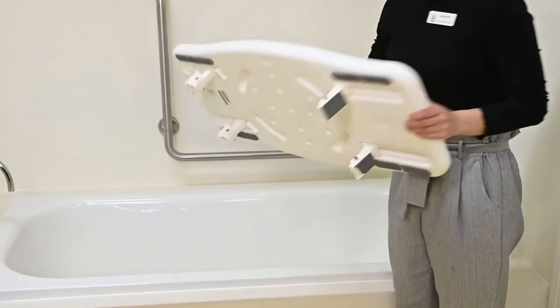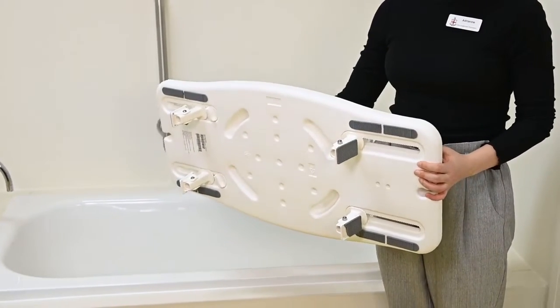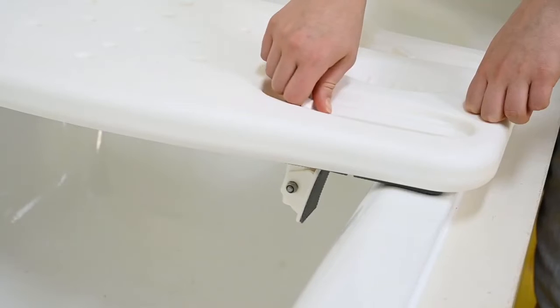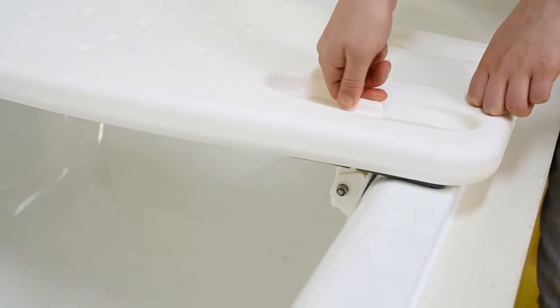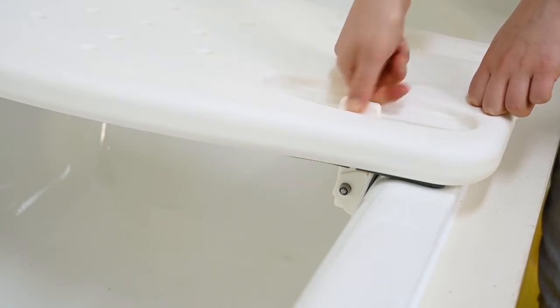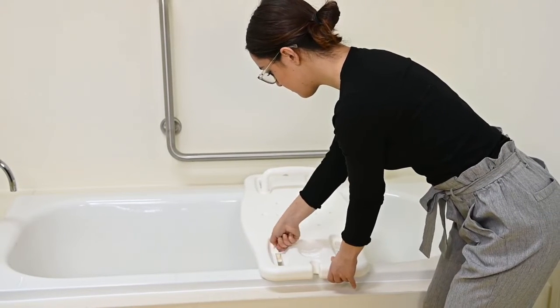On the underside of the bathboard, there are 4 adjustable brackets which hold the bathboard in place. Loosen the adjustable brackets and slide them out until they are firmly against the internal sides of the bath, then retighten the brackets in that position. Check the position of the bathboard — it should not move or slide.